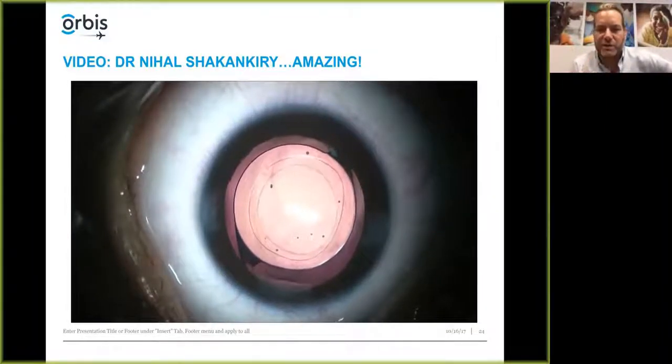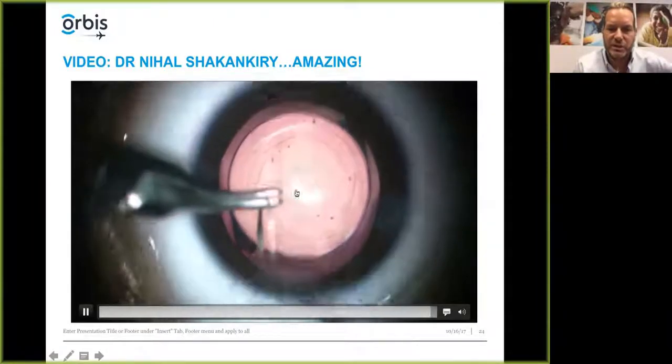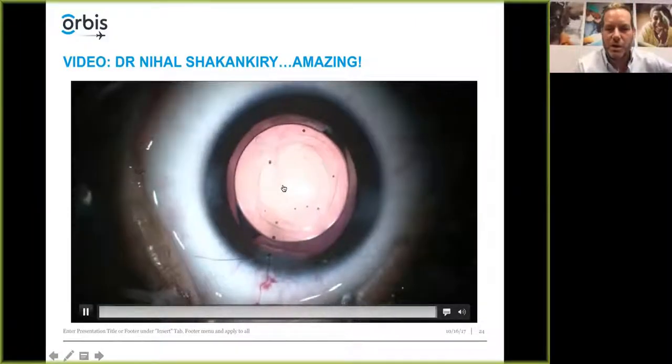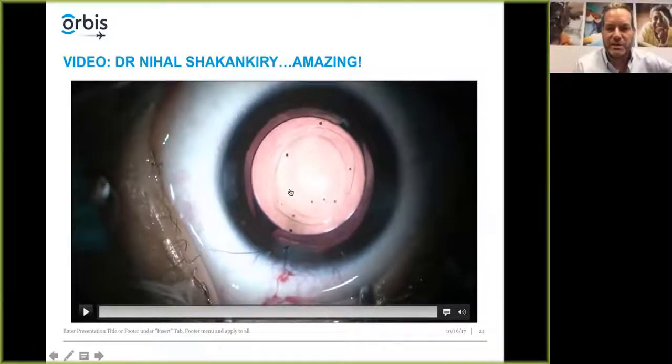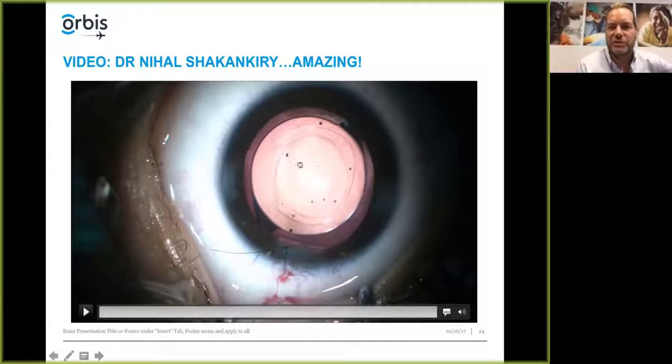But you just want this central area here to be free of vitreous and go back a little bit. I might have the vitrector in there just doing small amounts of vitrectomy, gentle circular motions for a minute, okay, to give you some rough idea of how much vitreous is being removed. You just don't want vitreous sitting right here, and you don't want it coming forward.